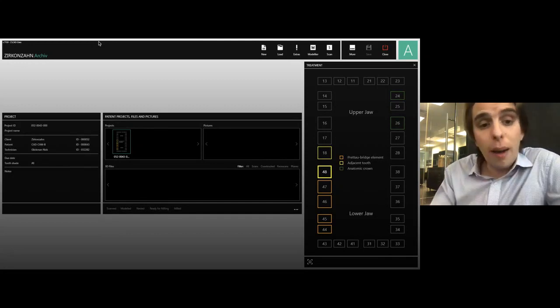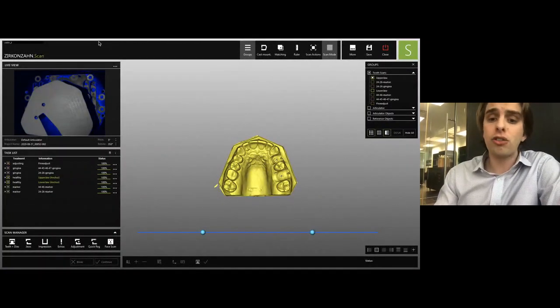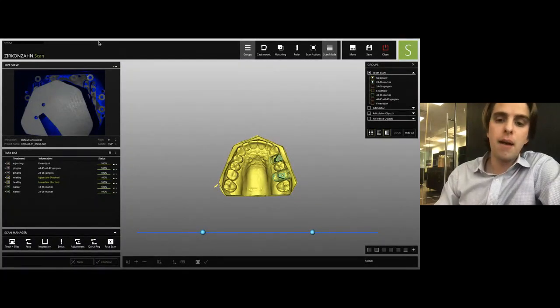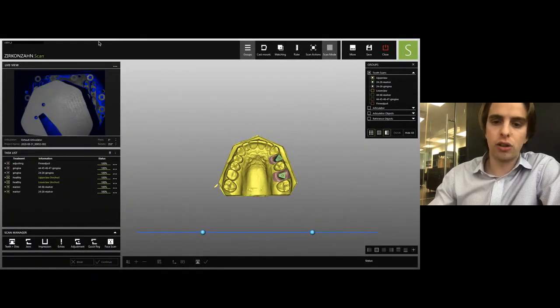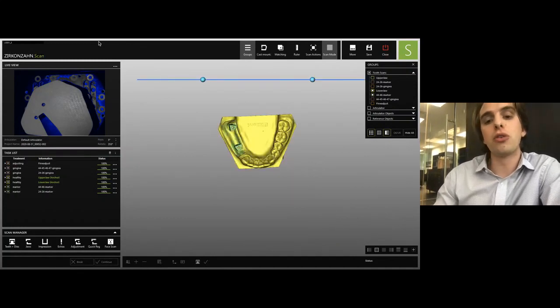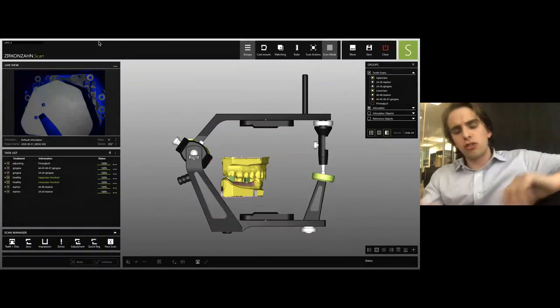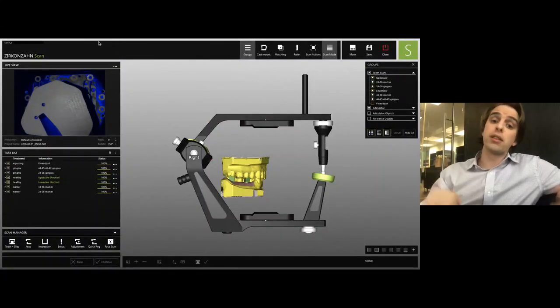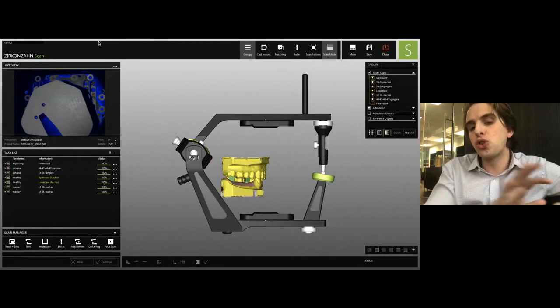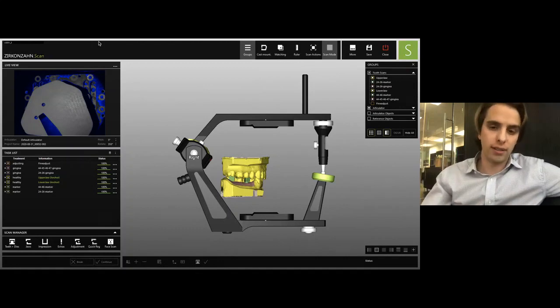So we go to set all of these options in the archive, and then we enter the scan software and we load the upper jaw master model with scan markers. This is an appliance that's used to index and locate the implant virtually. And certainly we also need a representation of the soft tissue. On the lower jaw, it's the same, the master model, the scan marker, and the tissue itself. Now, we notice, just like in the first case, that these models, when we imported them either through the desktop scanner or through an intraoral scan, they come into our virtual articulator in an arbitrary position. It's basically just, they're just throwing them into the coordinate system.